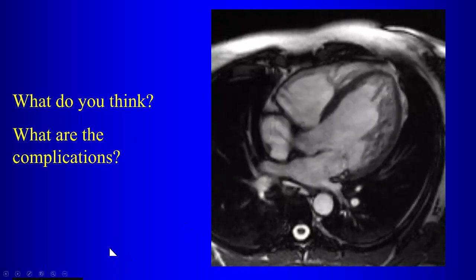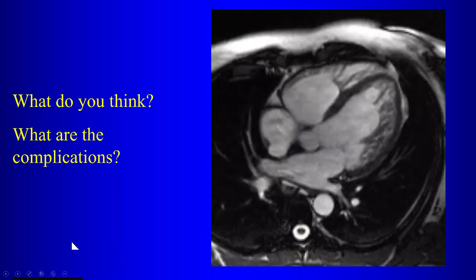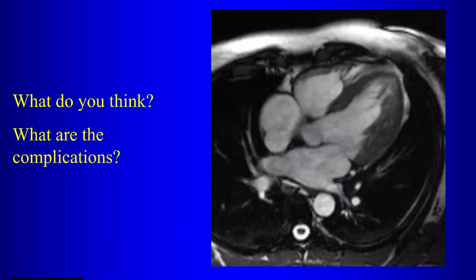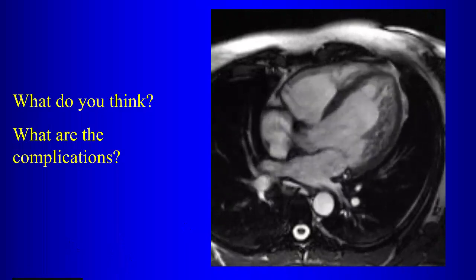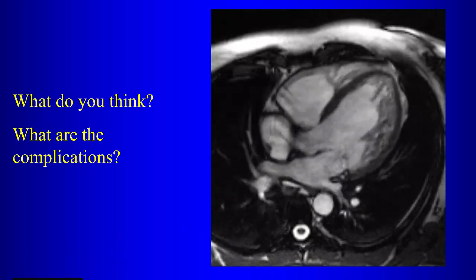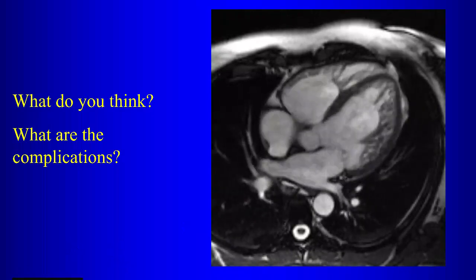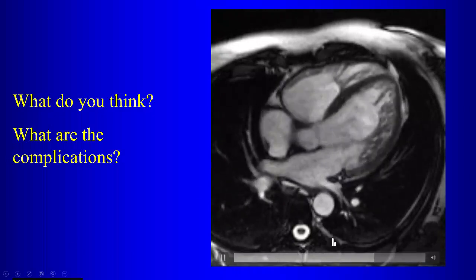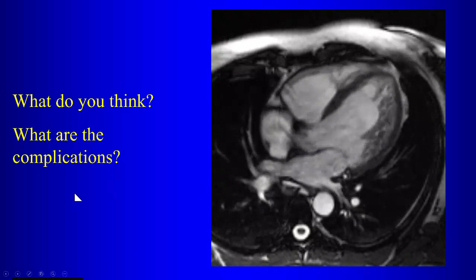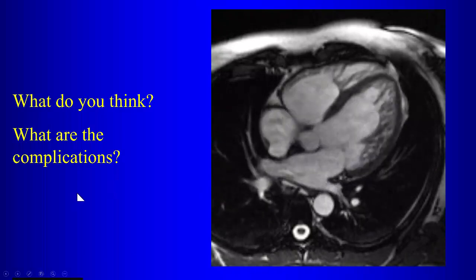Okay. Criteria for making the diagnosis with MR. What's the criteria for making the diagnosis with MR? More than 50% of the myocardium? No, not more than 50%. Where'd you get that? No, that's for the ratio. What's the number? So what you do is, first of all, do you look at it in systole or diastole? 2.3. 2.3, right. Do we look at it in systole or diastole?